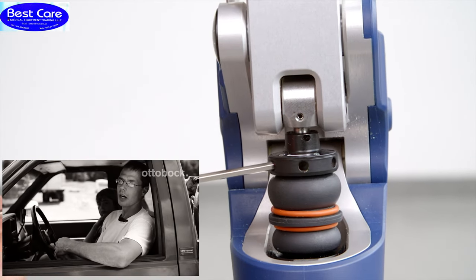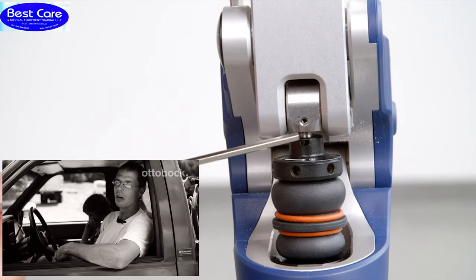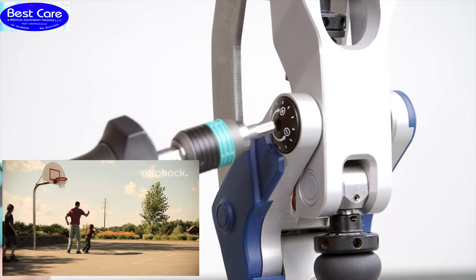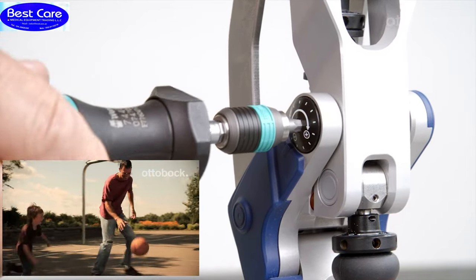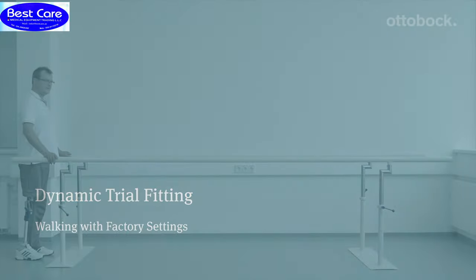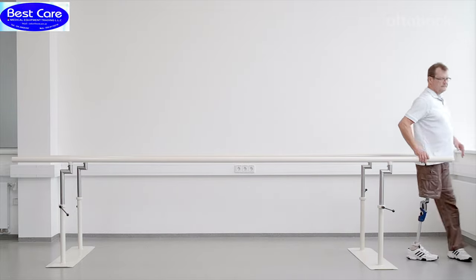For the EBS unit, the gap above the adjustment ring should be approximately 3 millimeters. Swing phase friction should be pre-tensioned to 0.5 newton meter by using a suitable torque wrench. To get a first impression of the swing phase control, let the user walk in the parallel bars with the factory settings.